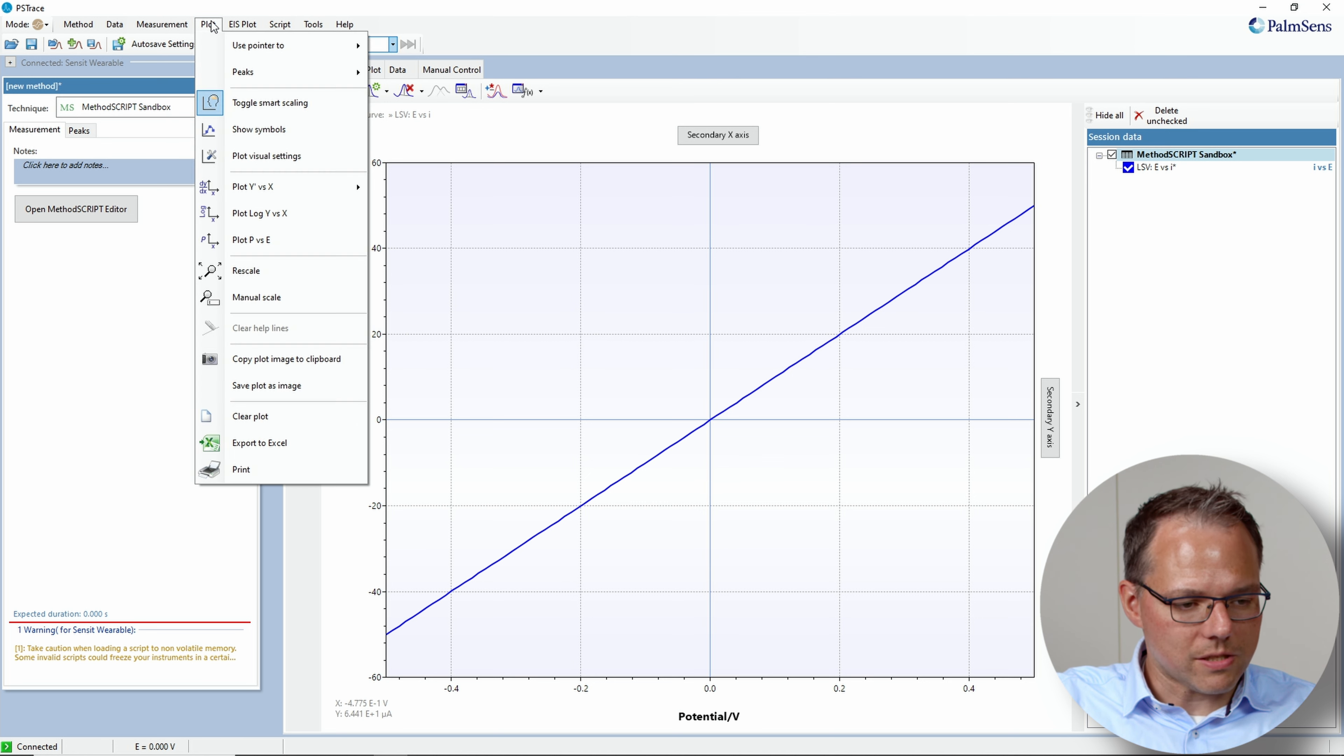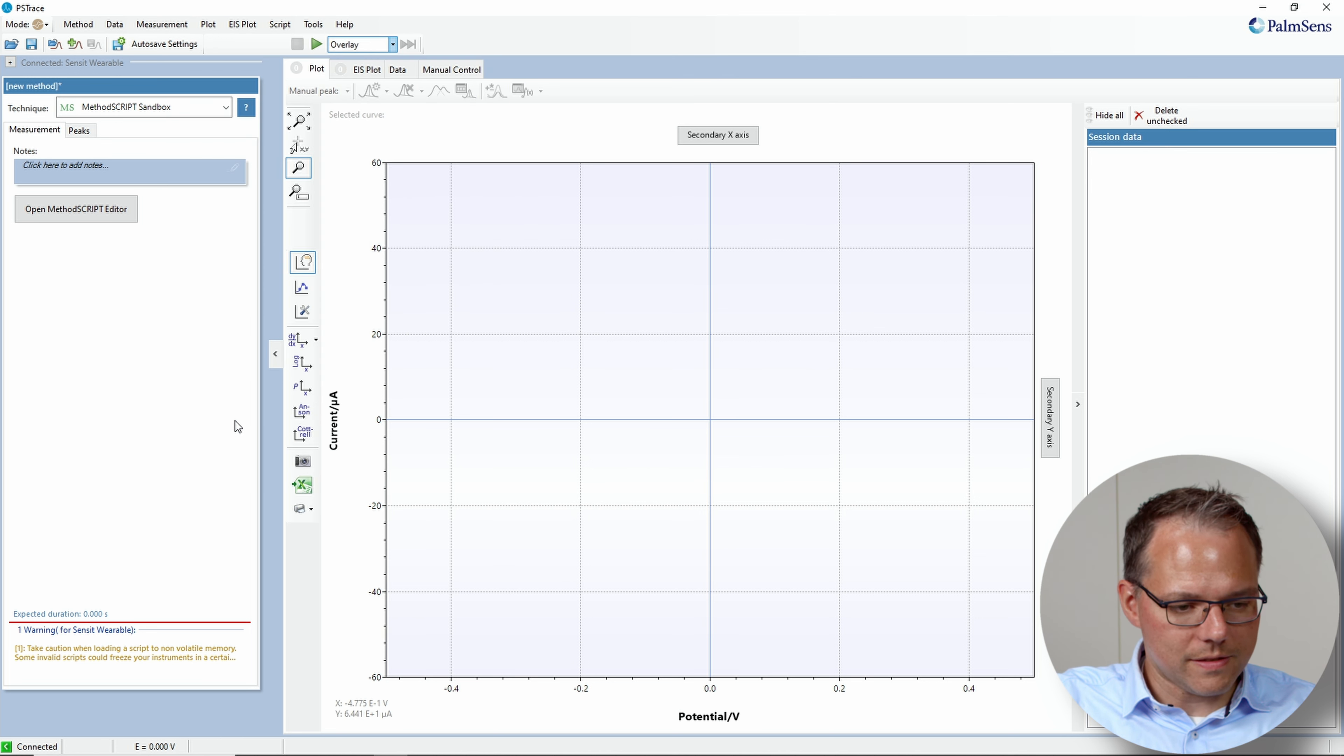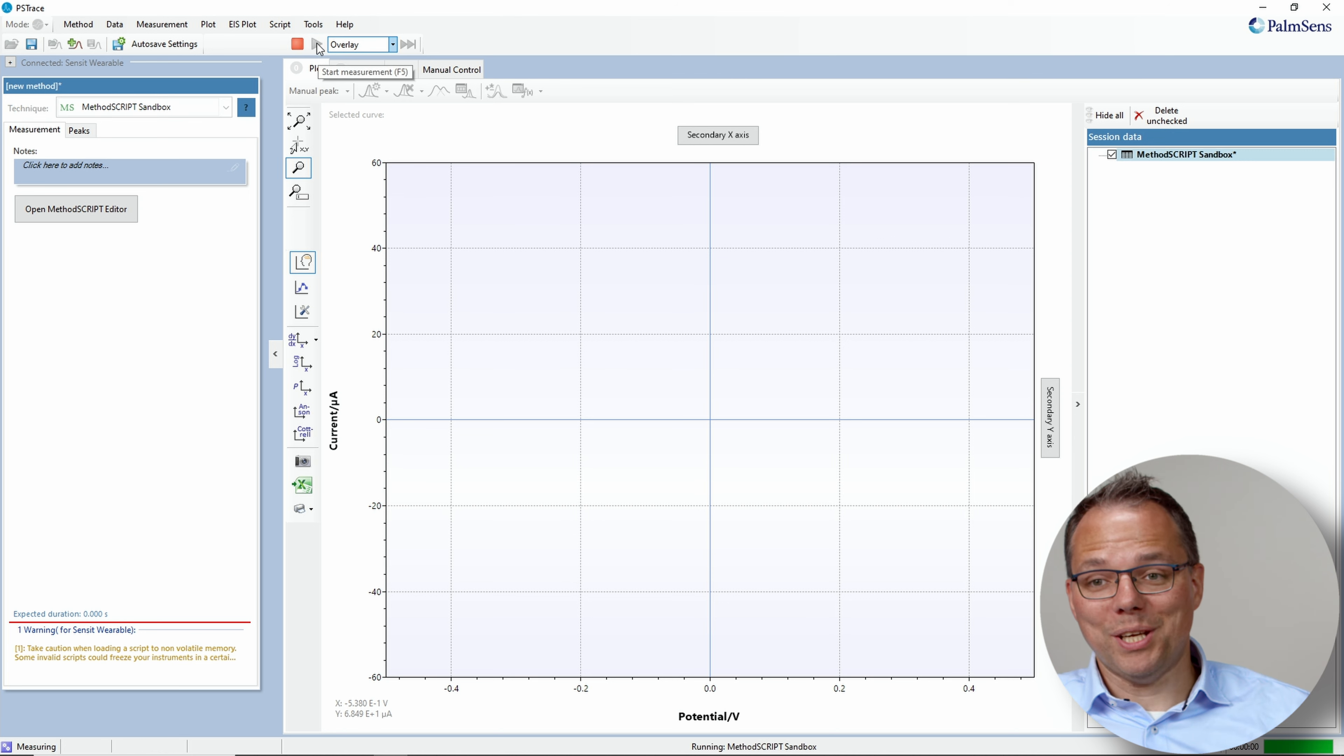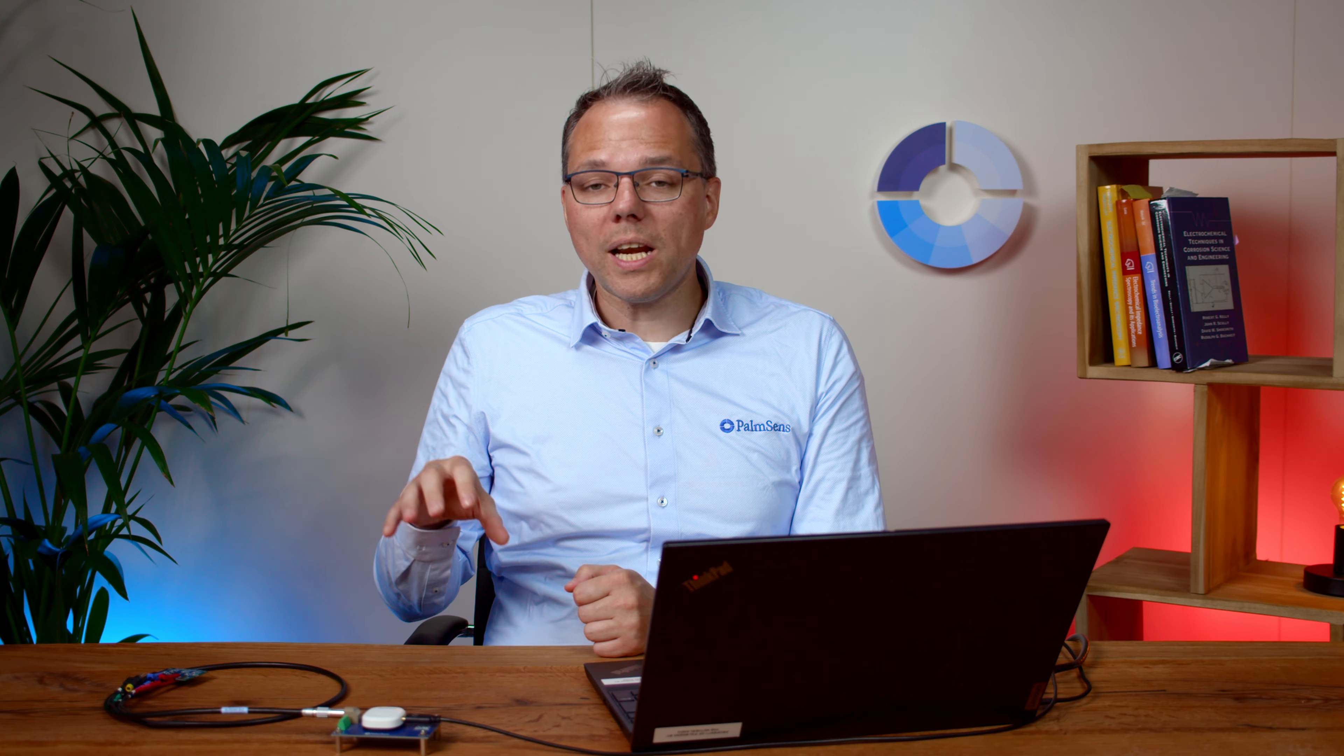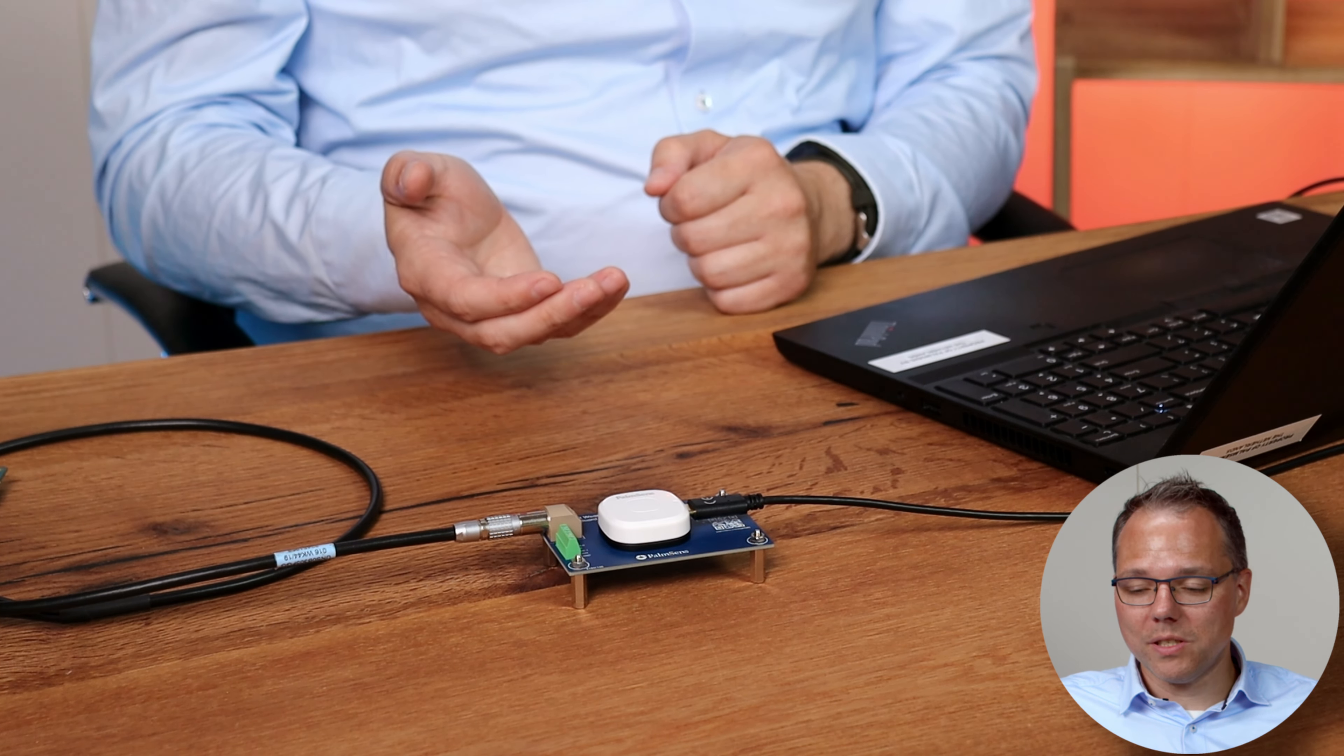First I just clear the plot to make it a bit easier to see that when I start the measurement nothing is happening. So when I activate the hibernate option, the device immediately goes to sleep when the script is starting.